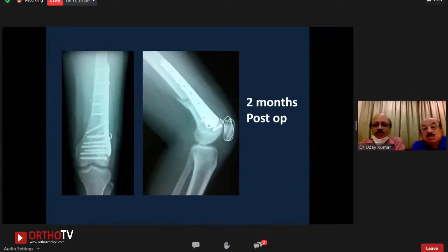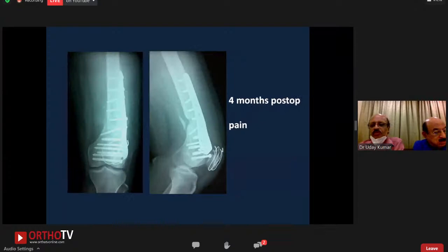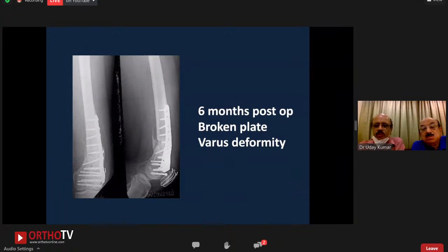This was around 2 months post-operative, all doing fine so far. And then the next. This is at 4 months post-operative. He complains of pain. And as described by Professor Justin, there is a bending of the plate, probably a plate breakage, going into varus, and even a flexion deformity. Yes, sir. Now, what are your thoughts, sir? This is at 6 months post-op. He has a broken plate. He has a varus deformity. And at this point, there is no evidence of any infection.